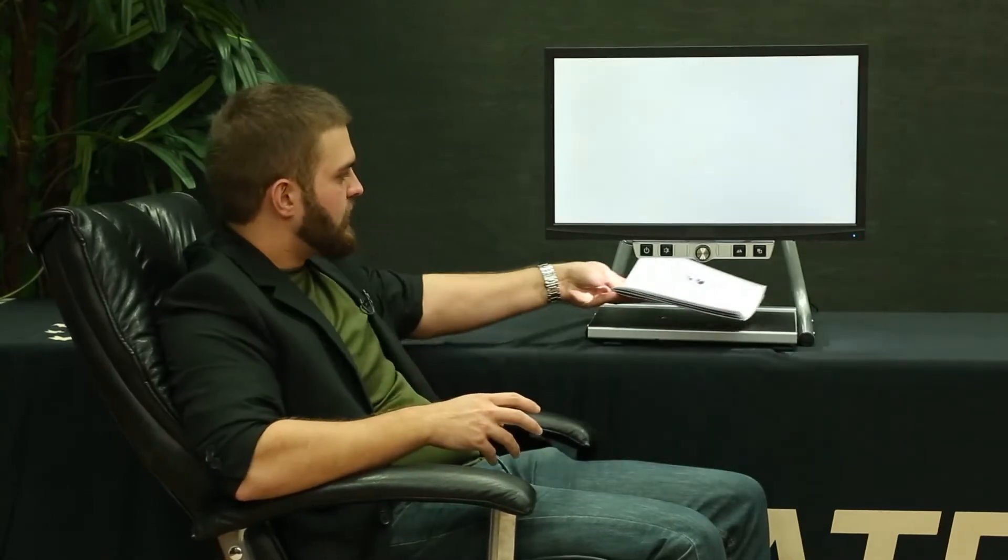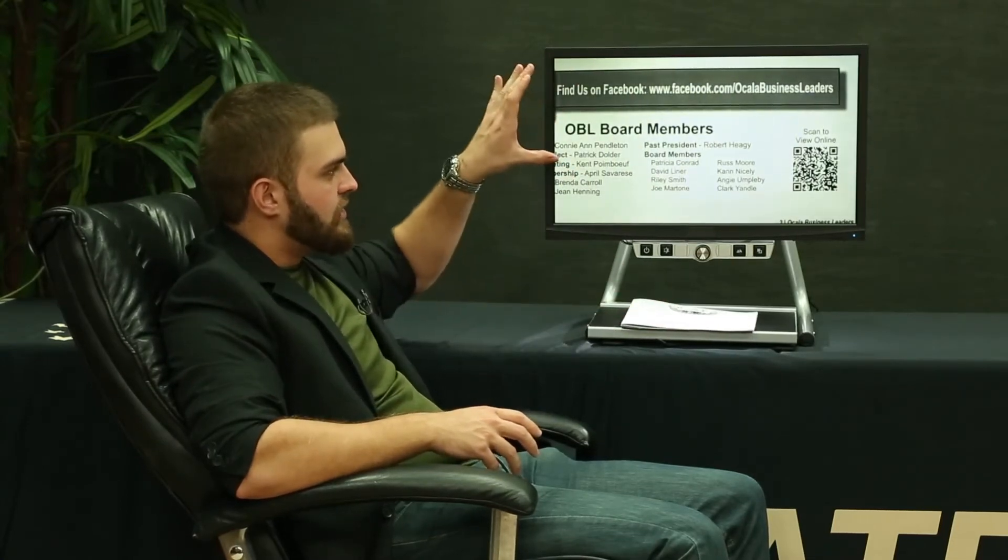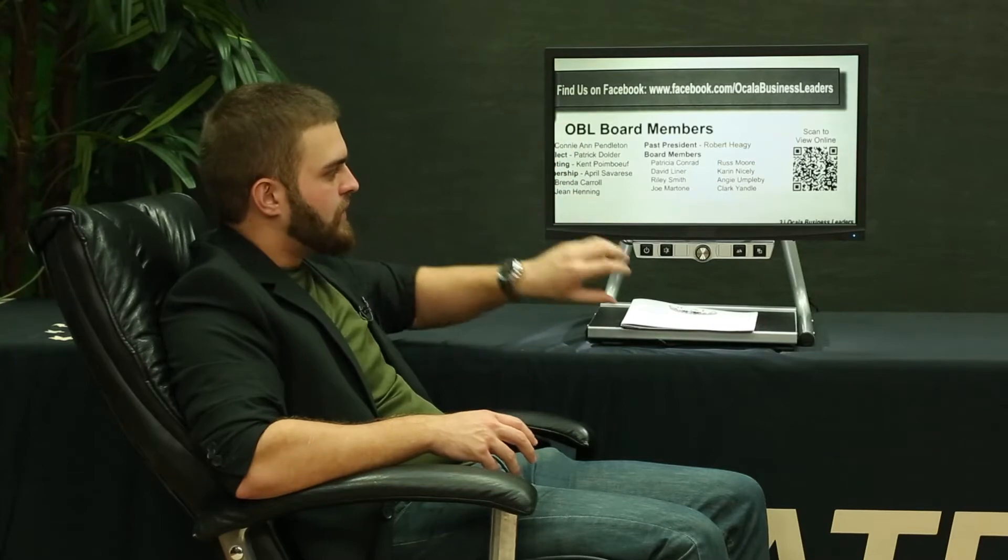The way it works is when you place documents underneath on the tray, you're going to be able to see the image magnified on the screen up above. There's a dial along the middle that you can zoom in or out with.